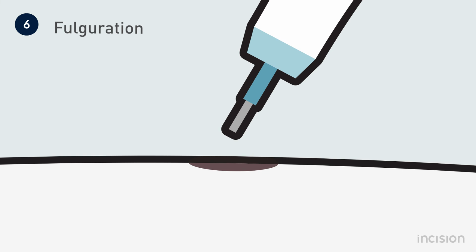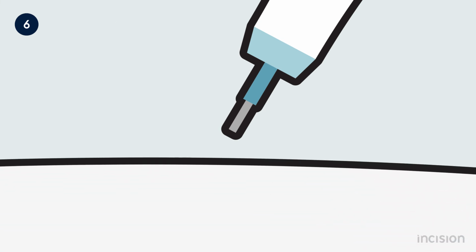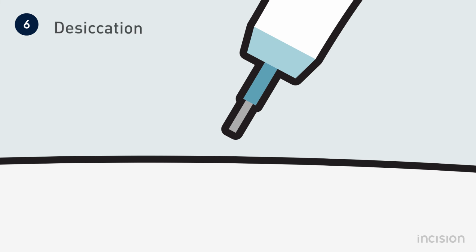This can be compared to preparing steak. To get a rare steak, it should only be placed briefly on a very hot grill, causing superficial heating and grilling. Another method of achieving hemostasis is the tissue effect of desiccation, also known as direct contact coagulation or pinpoint.